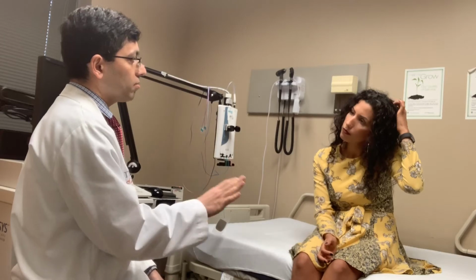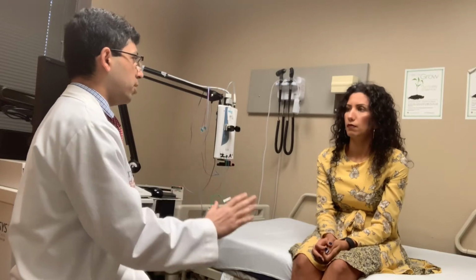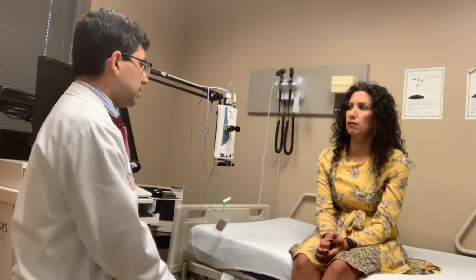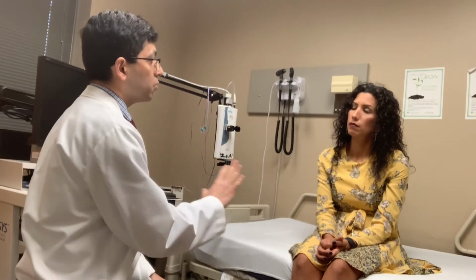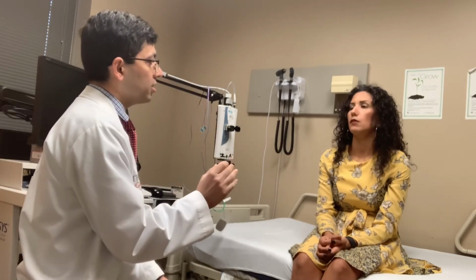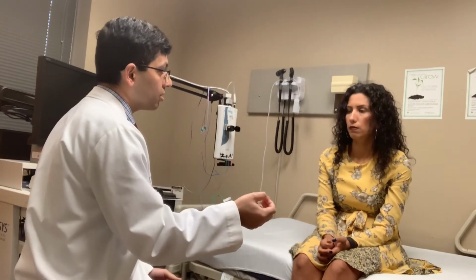Now, if you feel that this is something you are not able to tolerate or it's too painful, you can always tell us. You are the boss. You can let us know if you want a break, or if you want to stop the test. We will try our best to make you more comfortable, starting from small shocks and slowly going up in intensity. But you should be aware that we need to get the best responses of your nerves so that we don't misdiagnose you, so we will need to go to higher intensities. Okay. Do you have any questions?